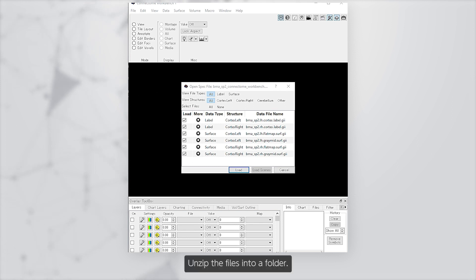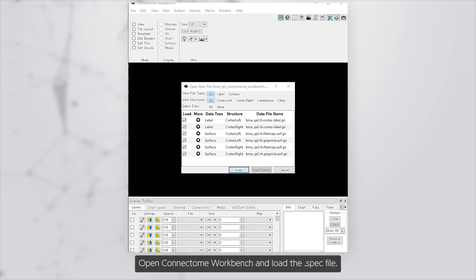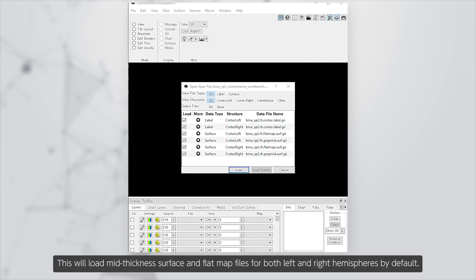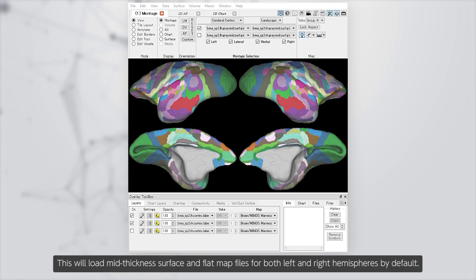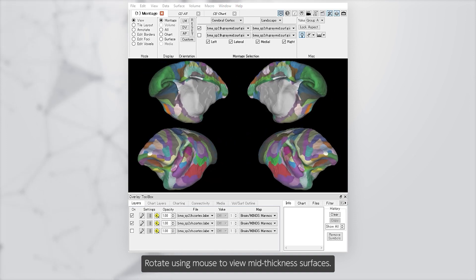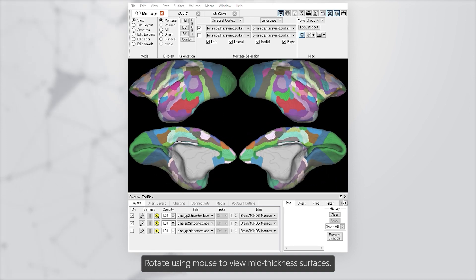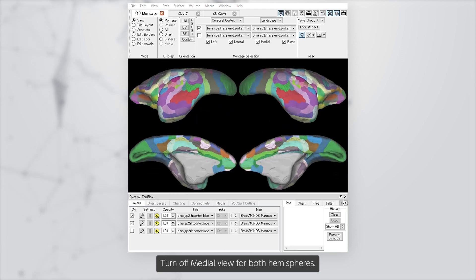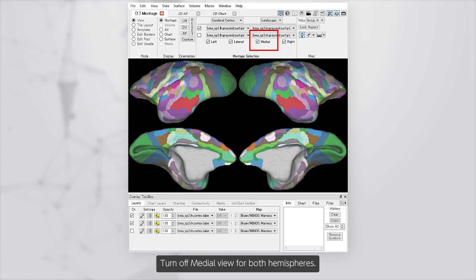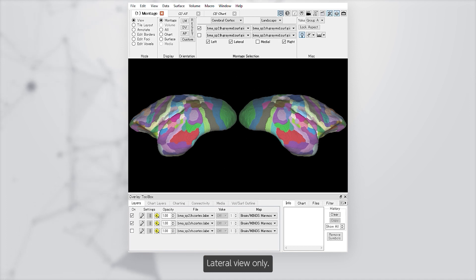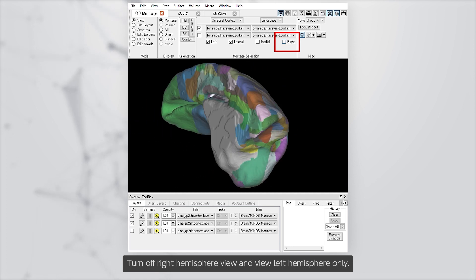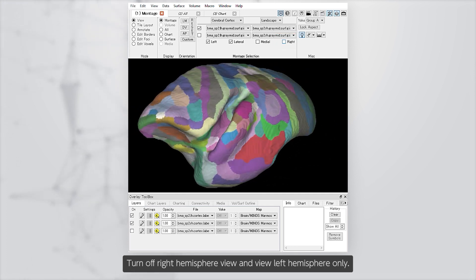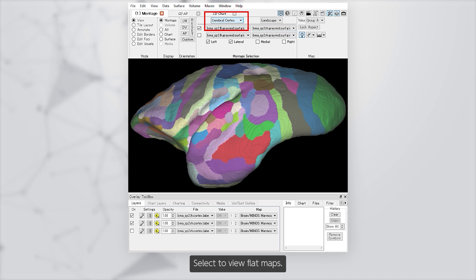Unzip the files into a folder, open Connectome Workbench, and load the dot spec file. This will load mid-thickness surface and flat map files for both left and right hemispheres. By default, rotate using the mouse to view mid-thickness surfaces. Turn off medial view for both hemispheres for lateral view only. Turn off the right hemisphere view and view the left hemisphere only. Select to view flat maps.